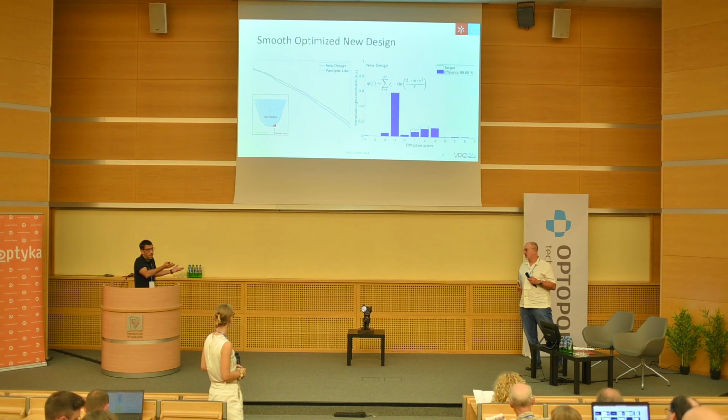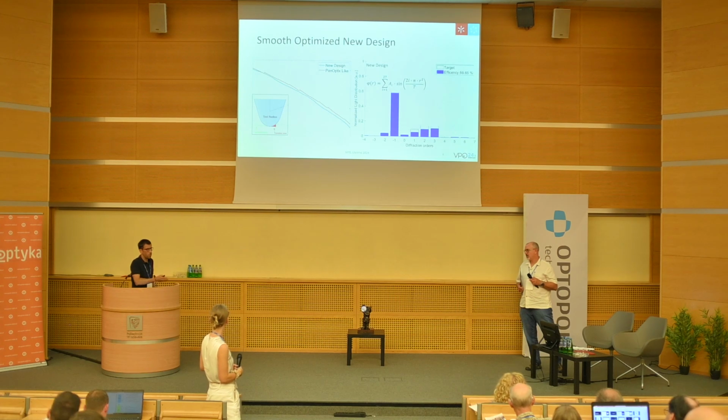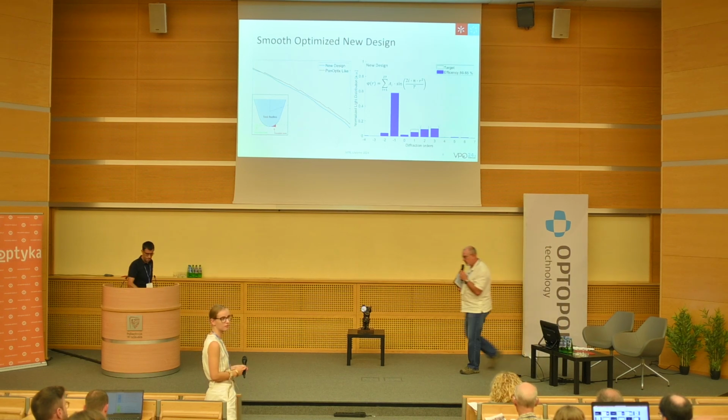In the sense that you define a diffractive, it's also a repeating pattern with discrete foci and inverse chromatic properties, etc. Thank you, Miguel. We move to the next paper.